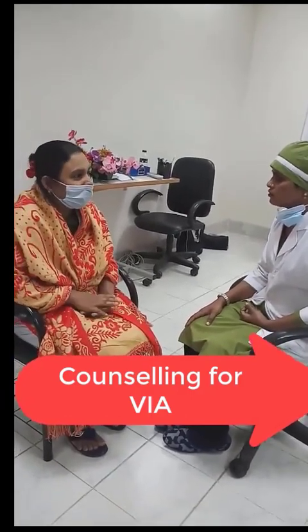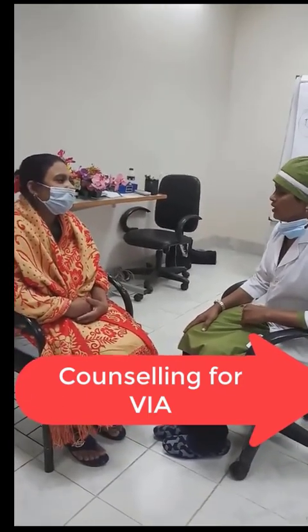This is a simple technique of inspection of the cervix via acetic acid. This is one of the screening methods for detection of carcinoma cervix. Other methods are Pap smear, HPV DNA test, and colposcopy. This technique is very simple and needs no cost at all.